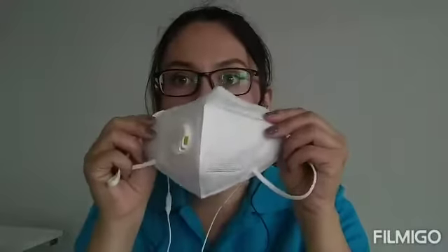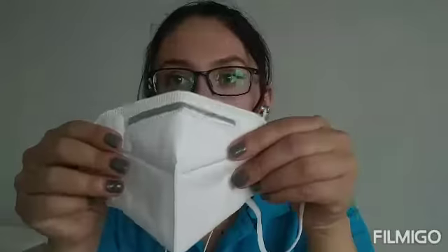The first thing we are going to see is the parts of the masks. The basic parts of the masks are the mask body, the ear loop, and the nose bridge. For flat masks, the nose bridge is basically built in, as you can see. For KN95, we have two types of masks: one with a built-in nose bridge, like this one, and the other type with an external nose bridge. So these are the types of masks that we have.